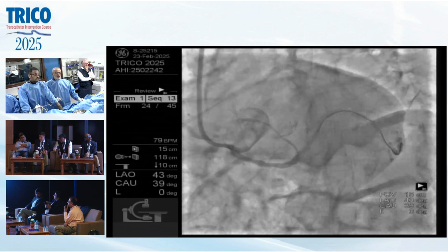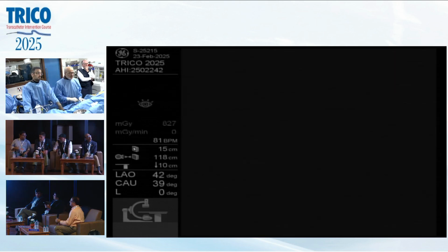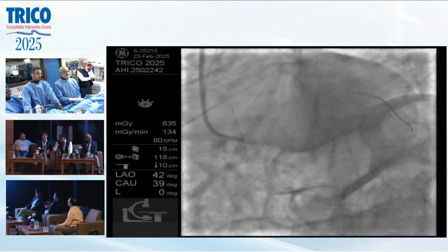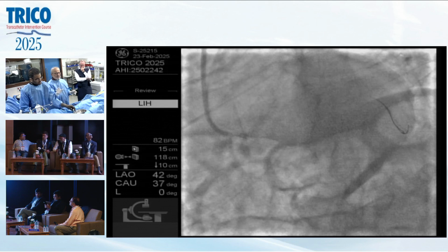I agree. Curvatures are good for a Cruise. We are going to use a Cruise in this case. Okay, and let me use Cruise. Only thing is, just like Xience, just like Onyx, I don't know, is this the observation with you guys or not? But like Xience, I never felt... I mean, 18 is 18, 23 is 23.